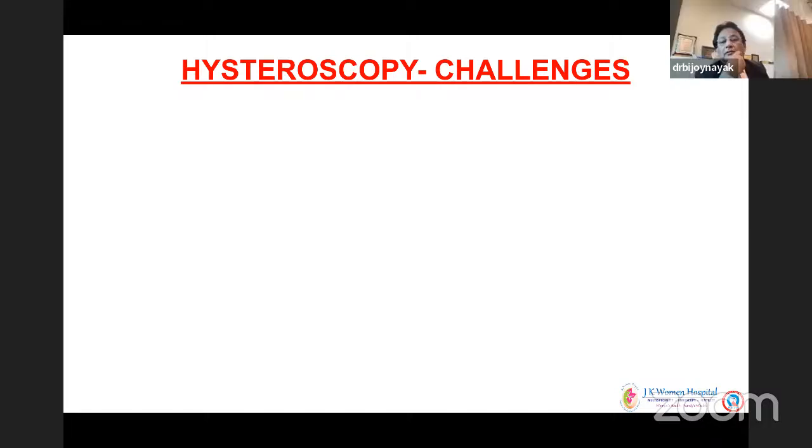The biggest challenge which we feel is with large myomas, submucous myomas, type 2 myomas, severe Asherman's, and balancing the completion of the surgery with fluid balance. Fluid overload should be avoided. These are some of the challenges I think we all face. I think the challenge is also entering into the uterine cavity. Yes, that's the main one, perfect entry. Entry into the uterine cavity, because the main problem or complication in gynecology was blind entry, which we all had to do with DNC. The complications with DNC were so many: false passage, perforation, incomplete evacuation. And that entry itself is the first thing, which is the biggest challenge for us.